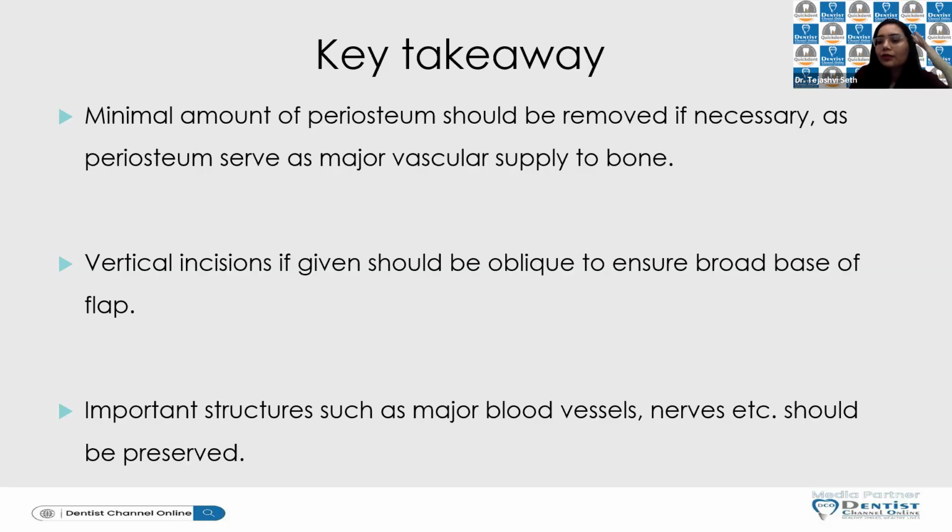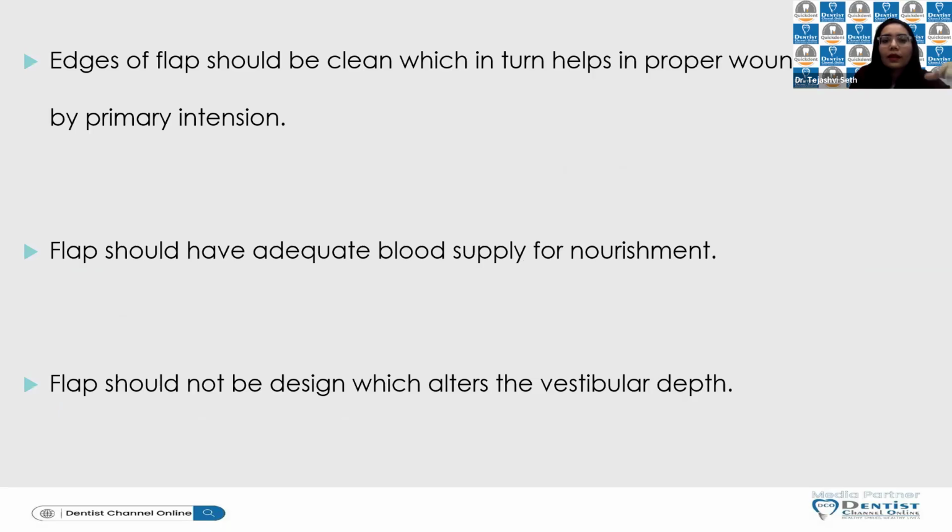So anatomy has to be always taken into mind before thinking how liberal you want your mucogingival release to be. In the sublingual region, you don't want any hematoma in your tongue space, that might even alter your respiratory passage. The edges of the flap should be clean.